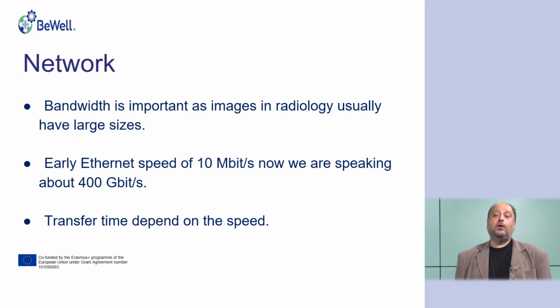But now we are speaking about 400 gigabits per second. So the transfer time depends on the speed, and of course the faster transfer is beneficial.